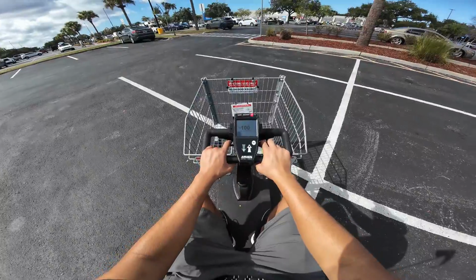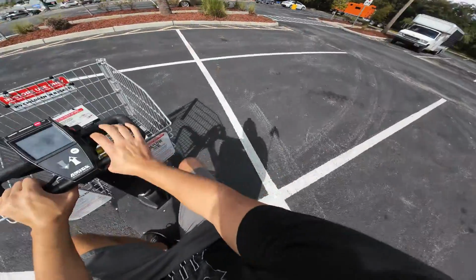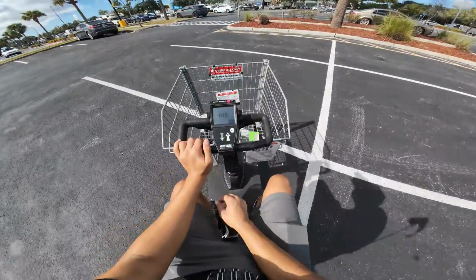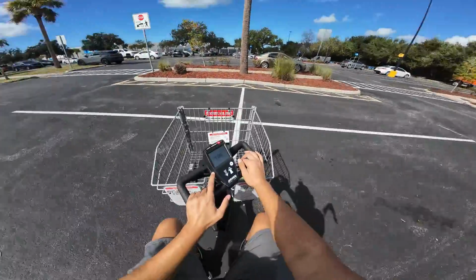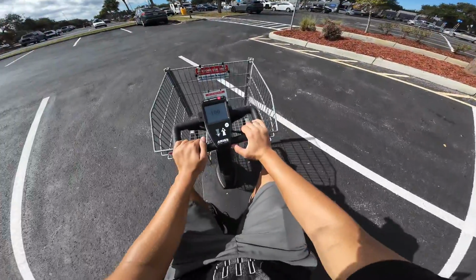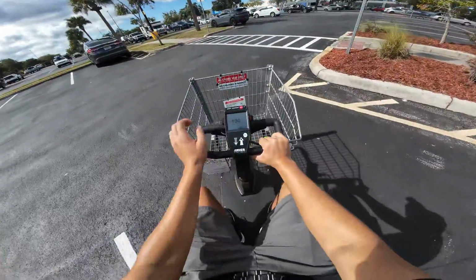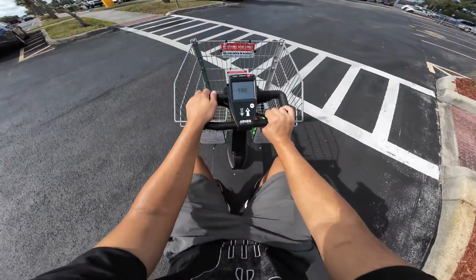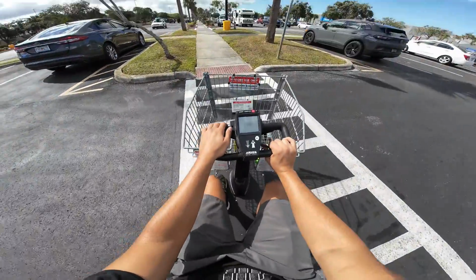All right, so yeah, let's start it. This right goes forward, left goes backwards, and as you can see, it beeps when it goes backwards. Take this around the parking lot. I really do look like a freak with this camera on, driving this mobility scooter, but who cares? It's actually pretty fun to just kind of chill in here and drive them.